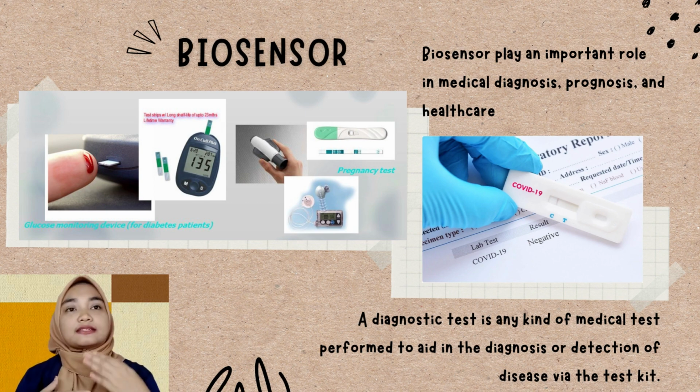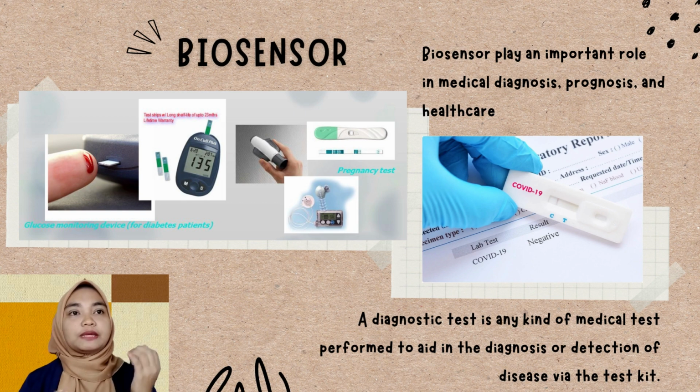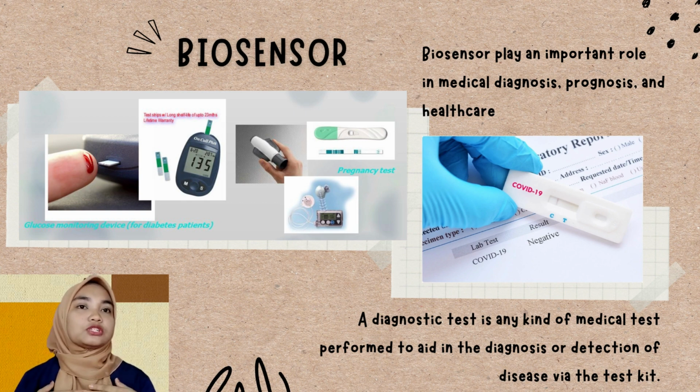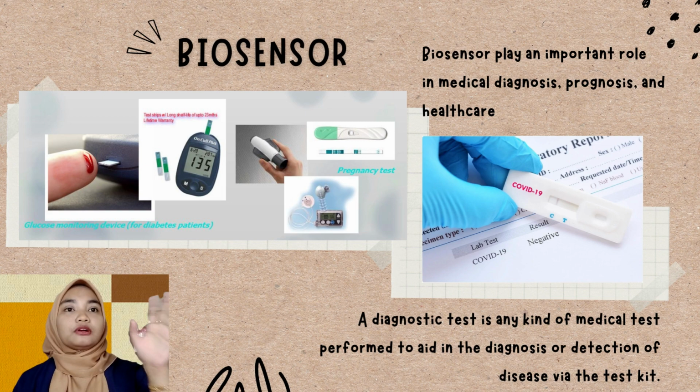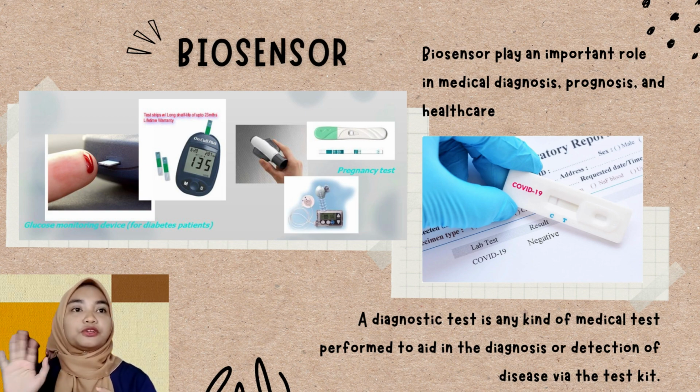The field of biosensors is focusing more attention on immunoassays as analytical tools to quantify analytes of biological interest. Also, polymeric membrane is used in an immunoassay to capture the matrix and serve as a solid surface. There are two modes of operation of diagnostic kits that are currently used, which are lateral flow assay and dot blot immunoassay.